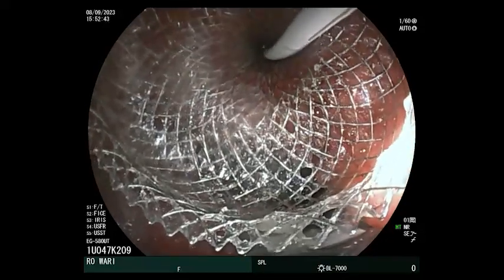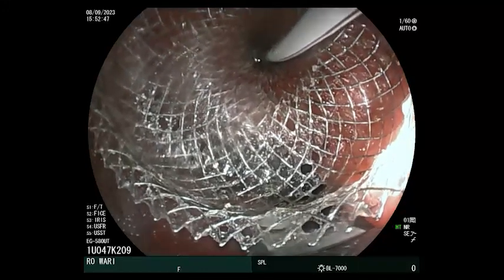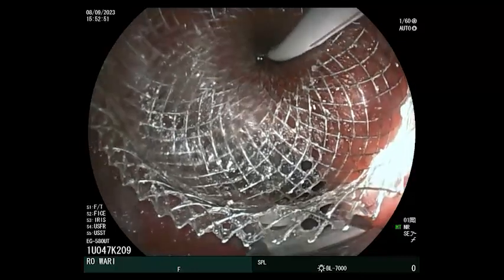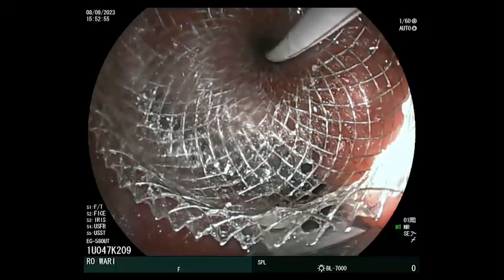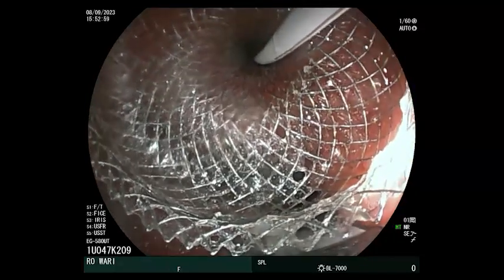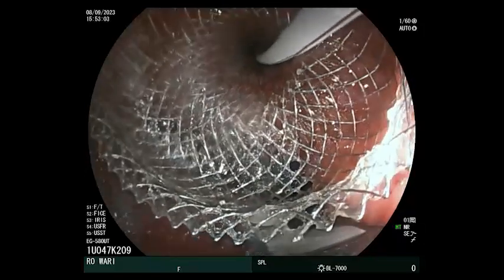Put you here. Down. Move it more. Not so easy. I think they have to go to another room. Okay, we're going to aspirate some fluid for bacteriology. If you move it, it's better.